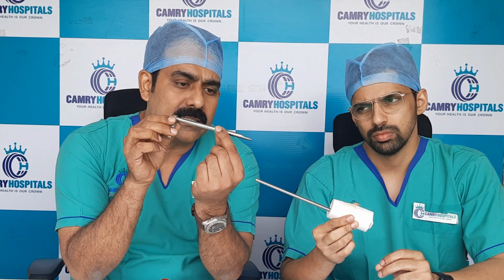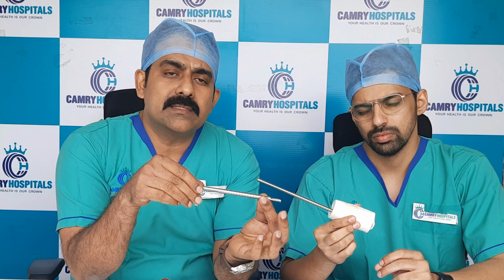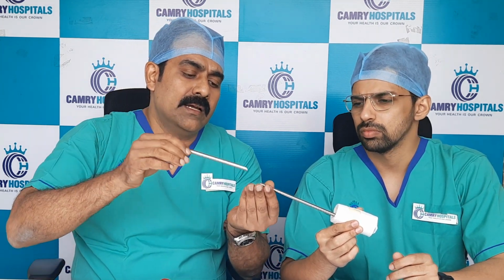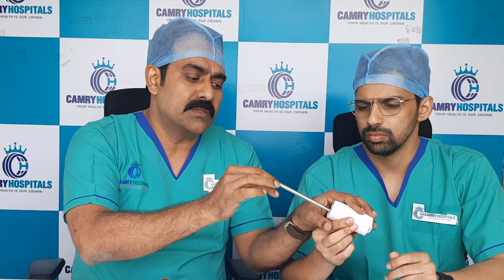Then this is called the cannula, or the obturator cannula. The inner diameter is 7 mm and the outer diameter is just 8 mm. So on the skin just an 8 mm incision comes, less than even 1 cm. After the incision, this channel goes in through the obturator. Again I check the position and take out the obturator. So now we are ready to go for the surgery.